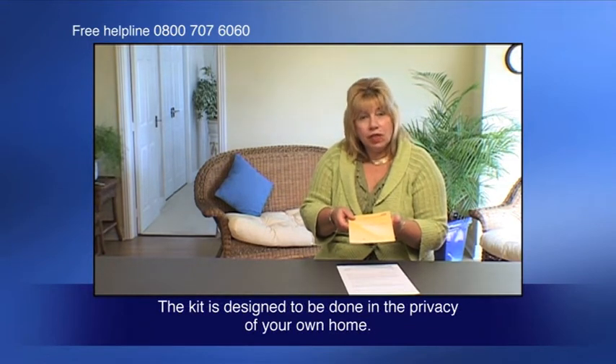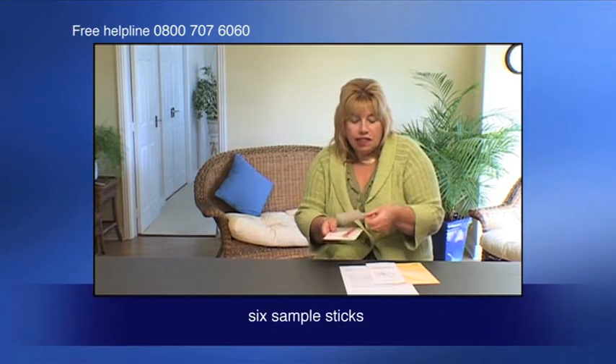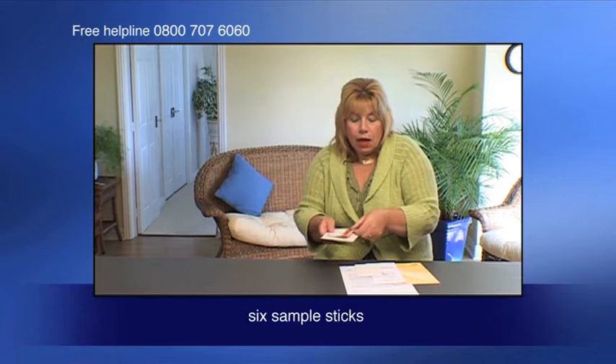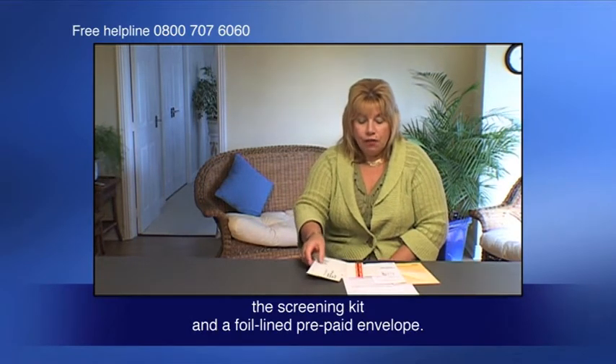The screening kit is designed to be done in the privacy of your own home. It contains a general information leaflet, a patient instruction leaflet, six sample sticks, the screening kit, and a foil-lined prepaid envelope.